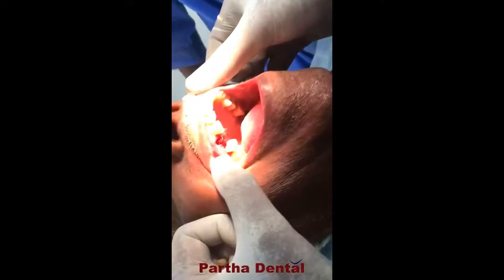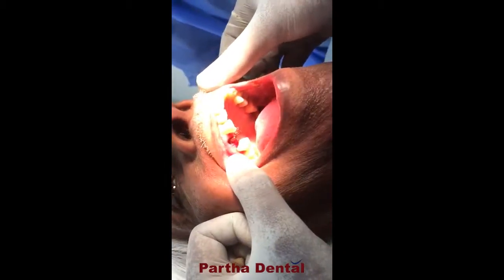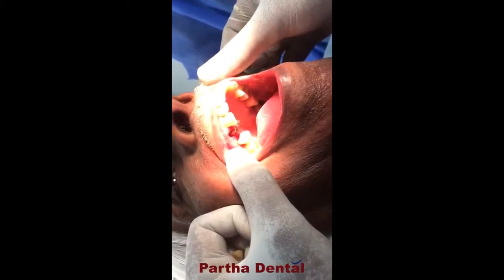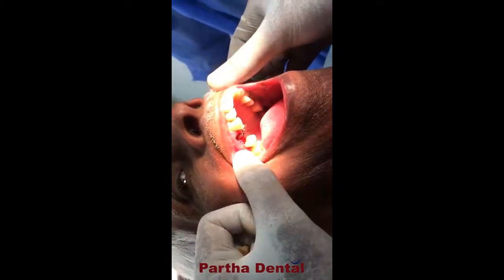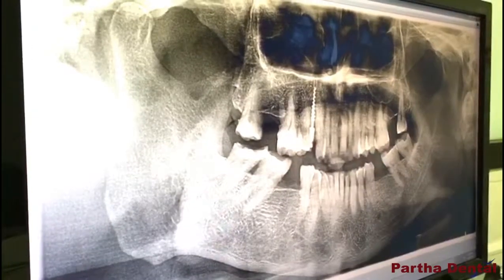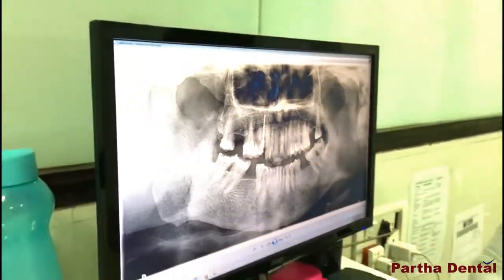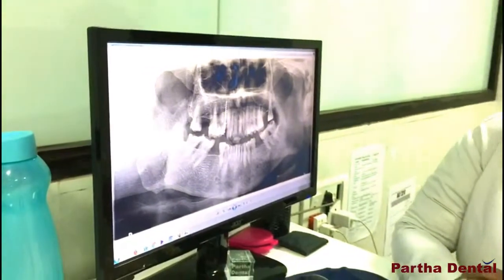After removing the tooth, the patient is fine. He does not have any discomfort and no pain. Here we have placed the implant after removing the tooth, and the patient is doing well with no discomfort or pain.